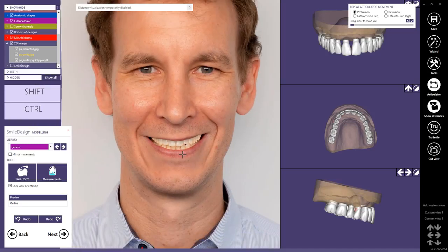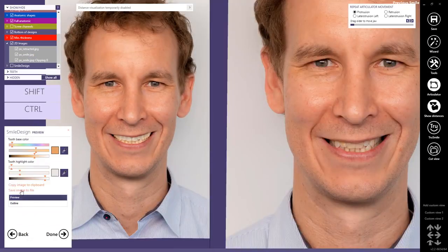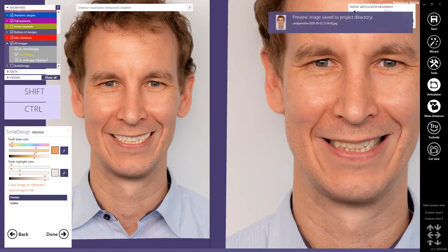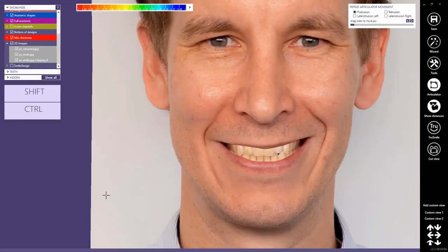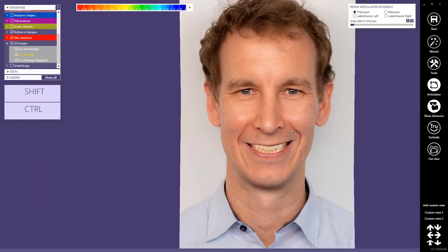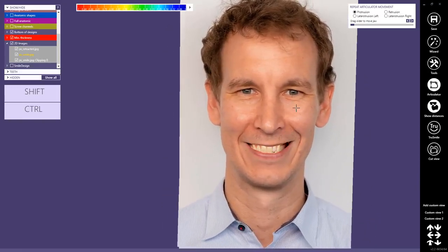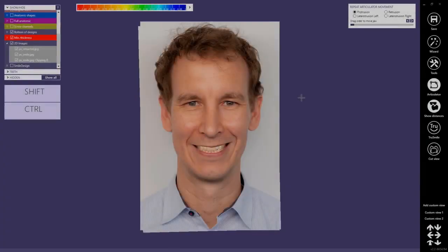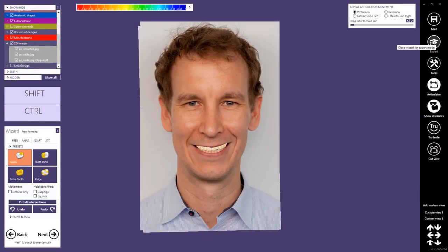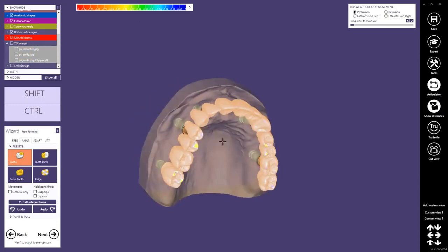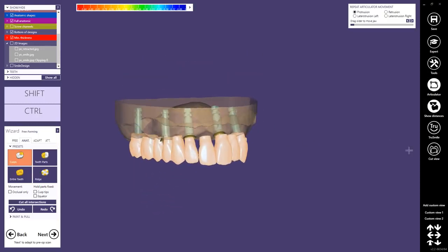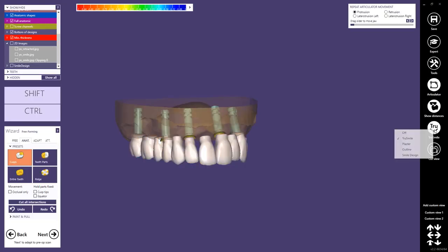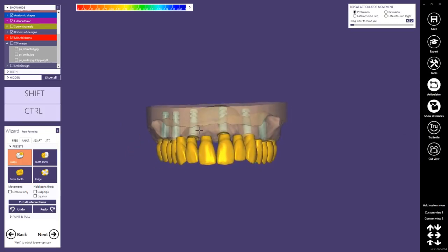You can even go back and work now with this improved colors, your preview, and still do some changes. Here you can now save this image to a file and send it to the patient or to the dentist. When you are done, click on this button and this will close the smile design wizard. If later on you want to look at the result again, just double click here on the picture and you will automatically get back the perfect orientation of the picture. Now we restart the wizard and the design will continue with the tooth rendering of the smile design. But we could also change that in the true smile button with the right mouse click. You can even change to true smile or simply use the normal design mode.